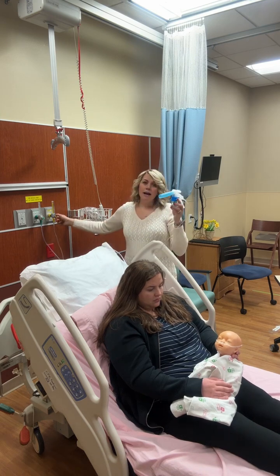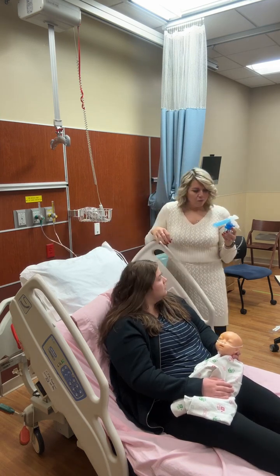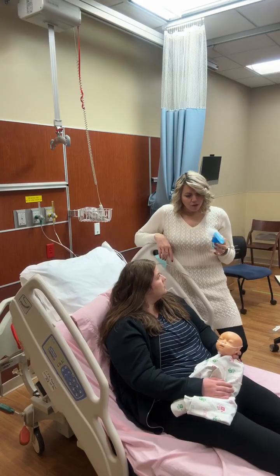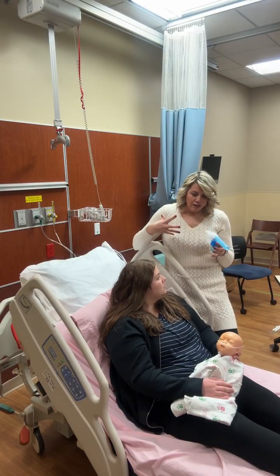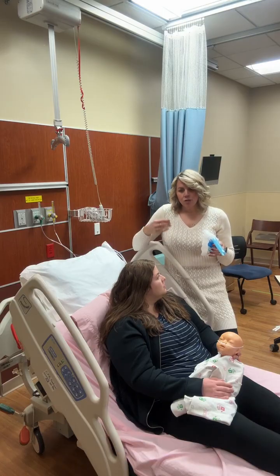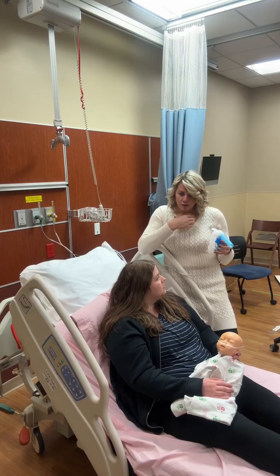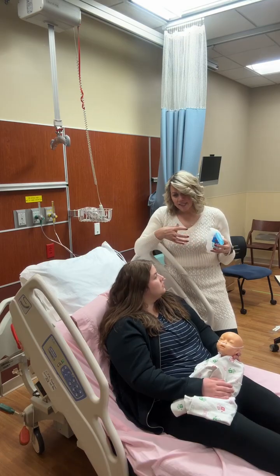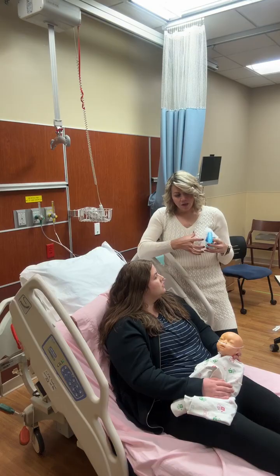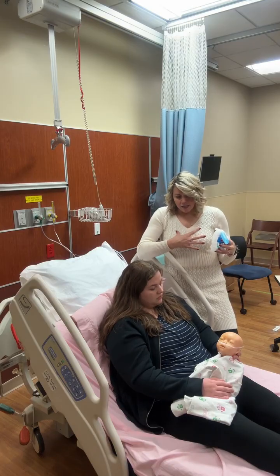And now I'm going to explain to Mom again what I'm going to do. Okay, Mom, so what I have in here is albuterol, and this medication is a bronchodilator. So it is meant to open the airways, the bronchioles, which is just a big term for the tubes that go into each of our lungs. And the way it does that is it dilates it. It's a bronchodilator, which means it's just going to open up the baby's airways so that she can take a deeper breath.